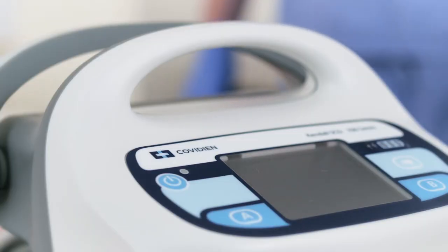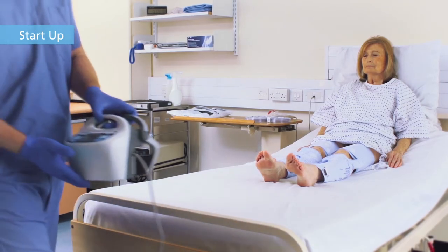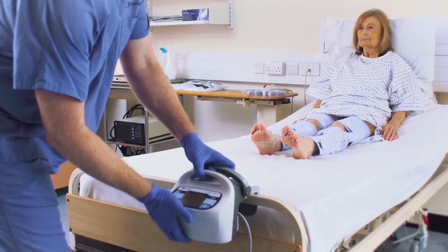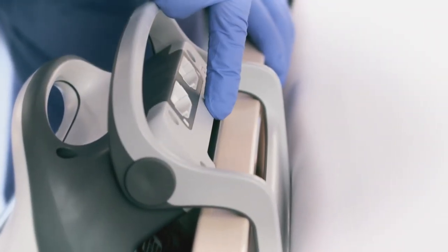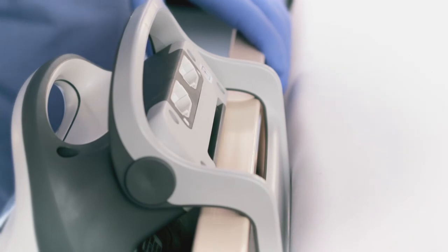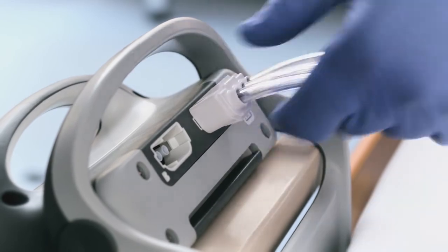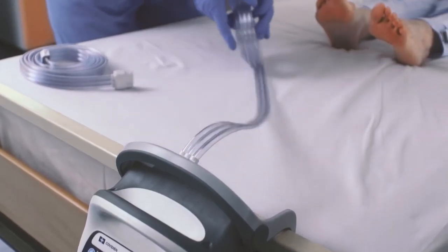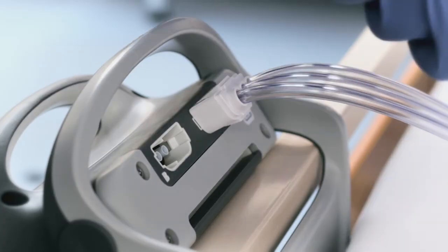Once the sleeves have been placed on the patient's legs, you can prepare the controller. Place the controller on the footboard of the patient's bed, ensuring the device is securely fixed to the bed and that there is adequate airflow to the vents. Plug the tubing sets into the back of the controller, then route the tubing toward the patient's limbs, being careful to leave access ways clear and eliminate tripping hazards.